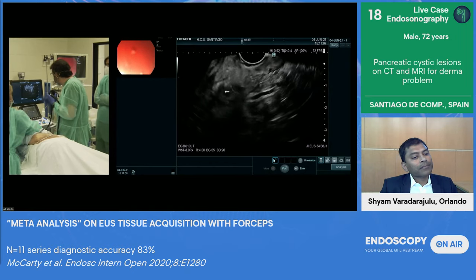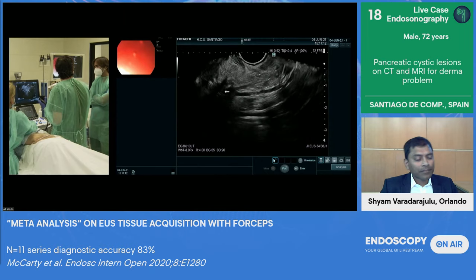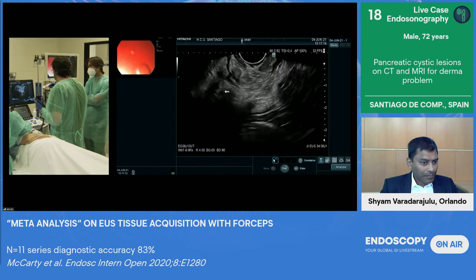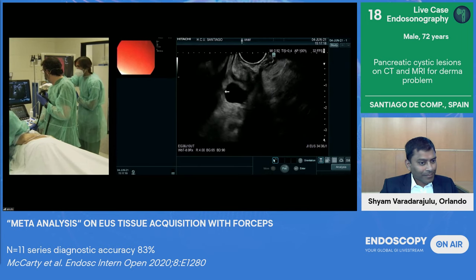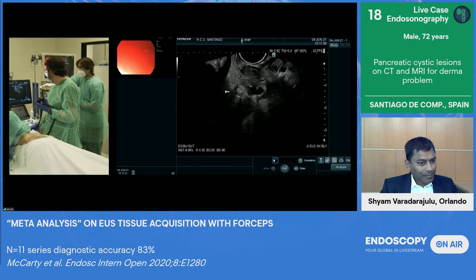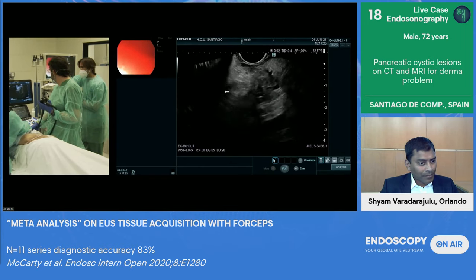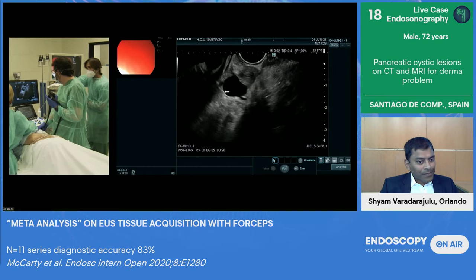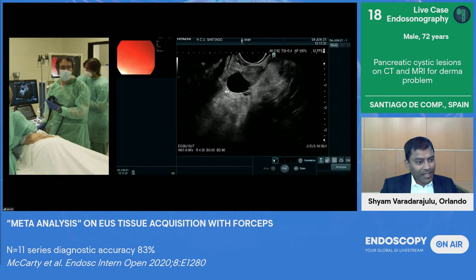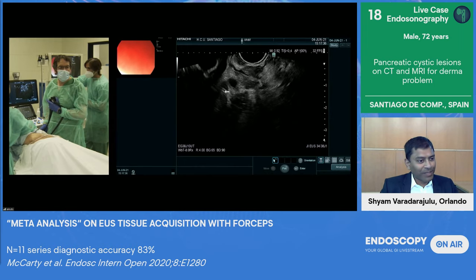So initially, I ask Dani and Jose, with these images, what would be your diagnostic approach before doing anything else? Yeah, it's a presumed IPMN, a multifocal branch duct IPMN. And so the question here is whether we are going to puncture the big lesions or not, which we are going to address in the next minutes. So what's your opinion, Julio? We have another 3 minutes before the end of this transmission. So if you would like to biopsy or do something, we have 3 minutes to complete this procedure.